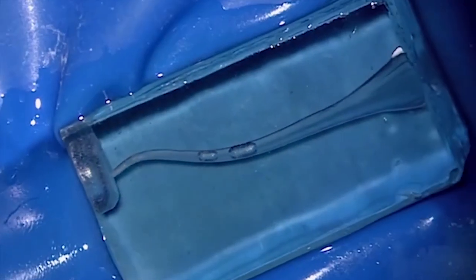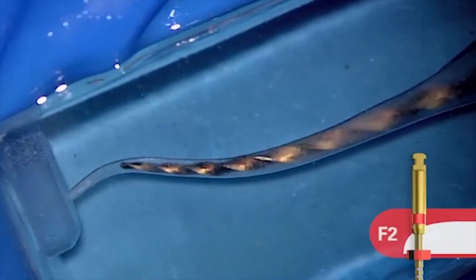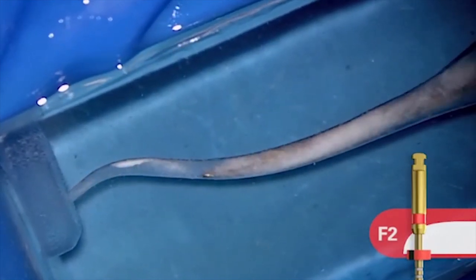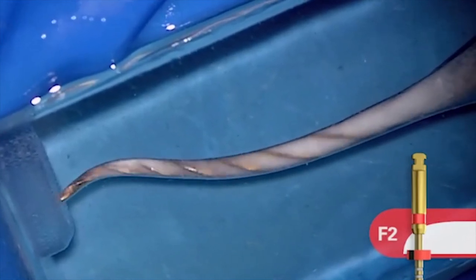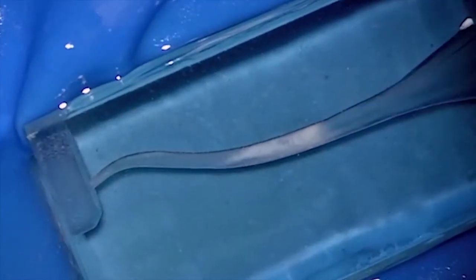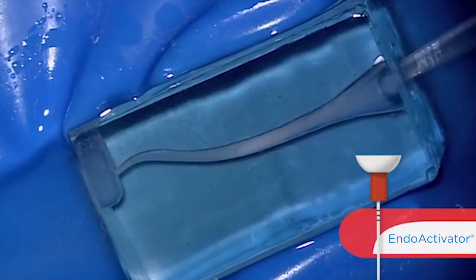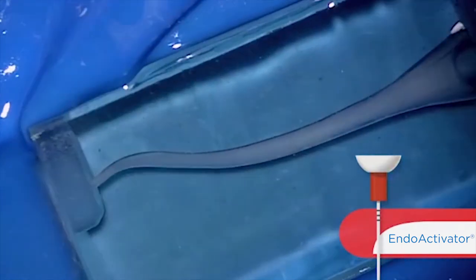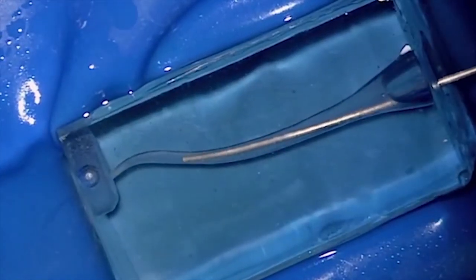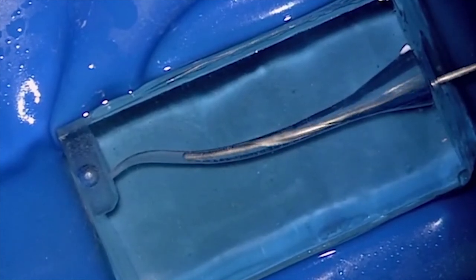Look at these files when they come out, especially the finishers, and see where they're cutting. We want to see debris on the more terminal blades of a file, which indicates that file just cut its shape in the apical one-third. It would be needless to continue going to higher-level files and expanding the diameter if the file is loaded — if it's loaded, we've just cut its shape and it's done. You can recapitulate this time with an endoactivator, break up debris, move it into solution. Notice how clean the canal gets rapidly by just following the endoactivator in and agitating the solution.